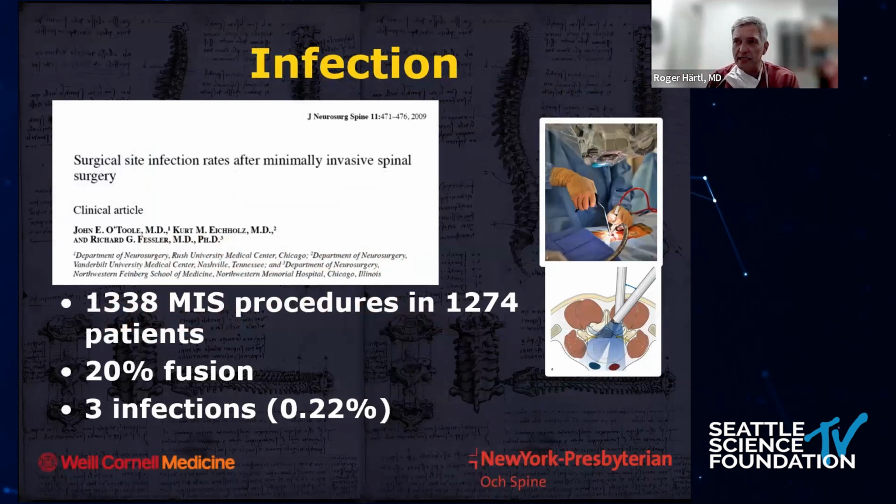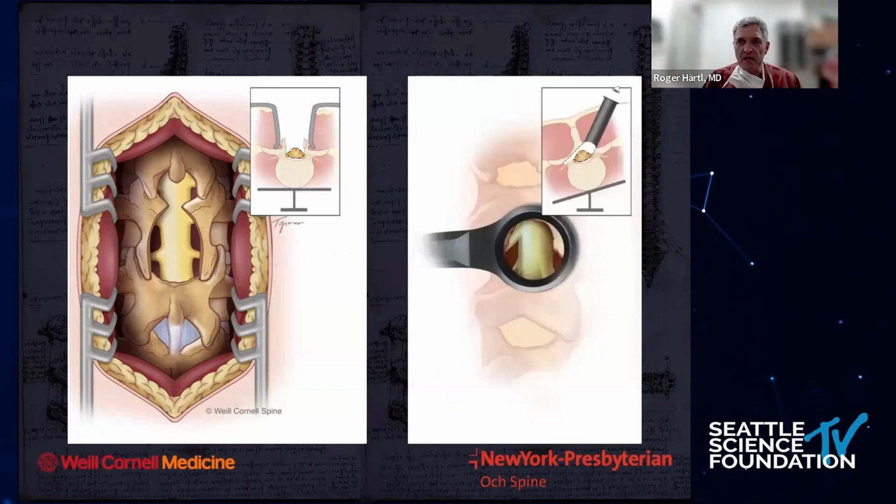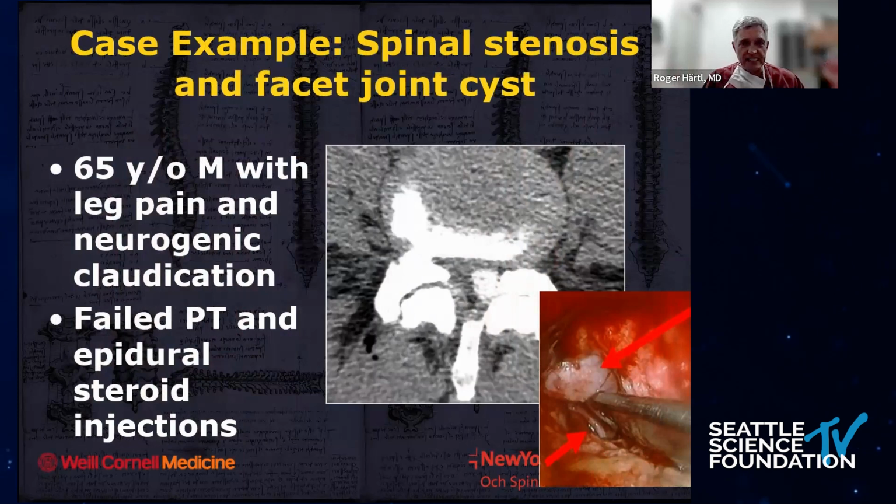That's probably the one thing that we've seen over and over again in all types of publications, endoscopic surgery, tubular surgery, MIS TLIFs, that infection rates are lower than with traditional open surgery. And probably that is because instead of having a lot of soft tissue exposed for considerable amounts of time, with endoscopic surgery, obviously you have the irrigation of water all the time. There's no tissue exposed really. And with tubular surgery, you have very, very little tissue exposed. And I think that's probably one of the main reasons why infection rates are so low with MIS.